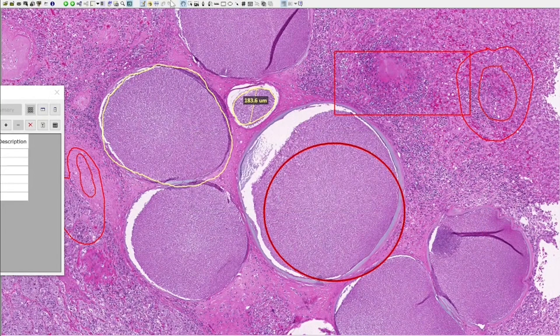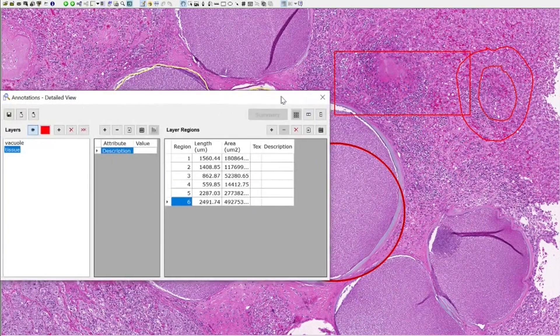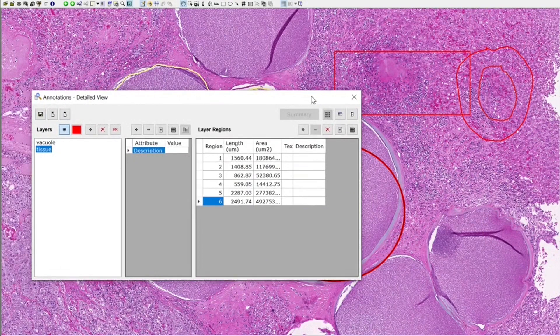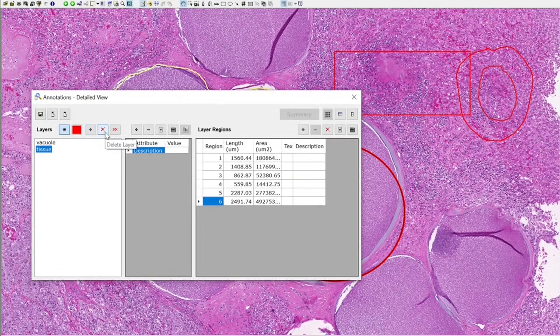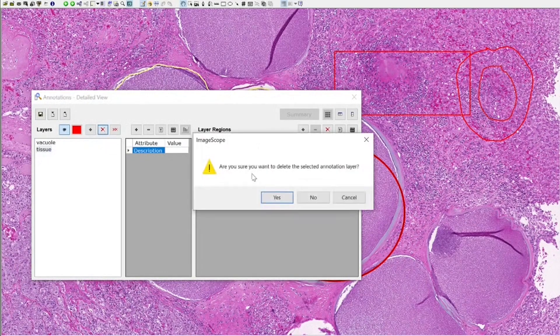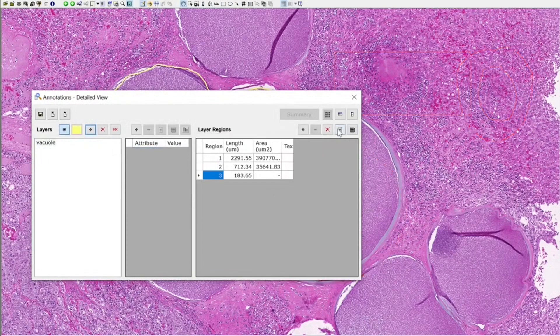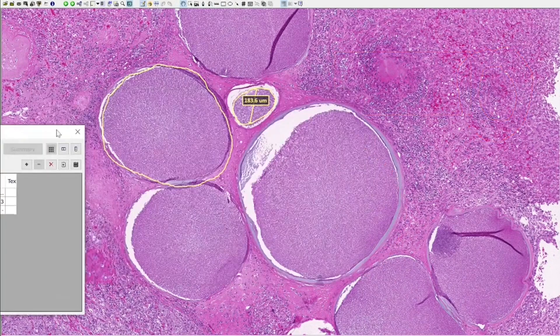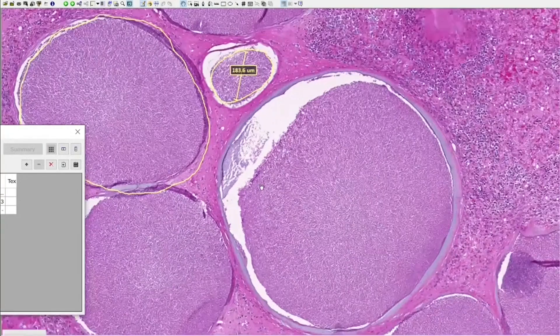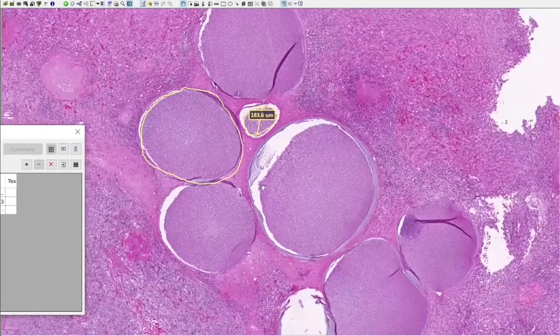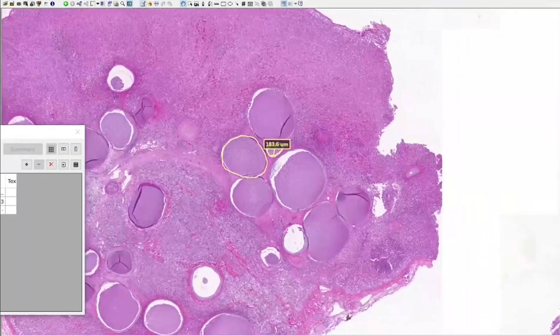If I want to delete everything from a class, I go back to my detailed view and I click on this cross delete layer. I'm going to delete my whole tissue layer. Yes, I'm going to delete. That leaves me with just one layer of my vacuoles.